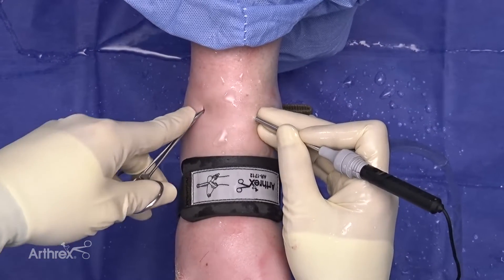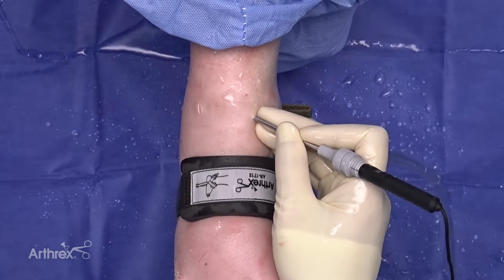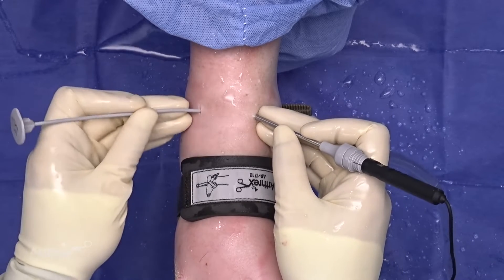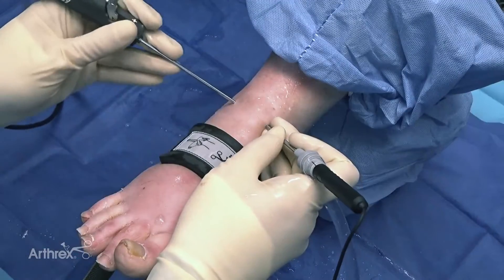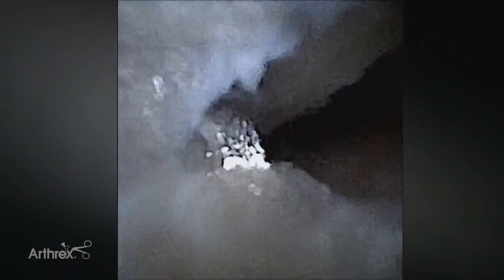I'll back my scope up out of the way so I can enter the joint. I like to insert the blunt obturator first so I know that I'm in the joint — I've triangulated. Then I can insert my Nano Sabre shaver into the joint and begin debriding some of the synovitis from the anterior aspect of the joint. I make sure to visualize the shaver at all times so I'm not damaging any cartilage or causing any iatrogenic defects.